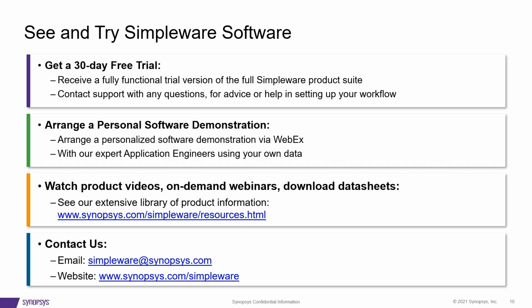Excellent. What is the segmentation processing time like with AS Ortho alone? So that one finishes in about 5-6 minutes. It segments the femoral cartilage, tibial cartilage, and patella, and fibula, of course. And then screening and going through all the masks again takes another 10-15 minutes, I think, just to make sure that the segmentation is okay.